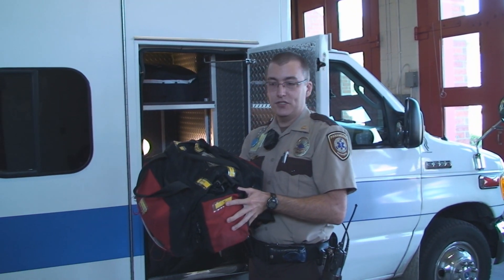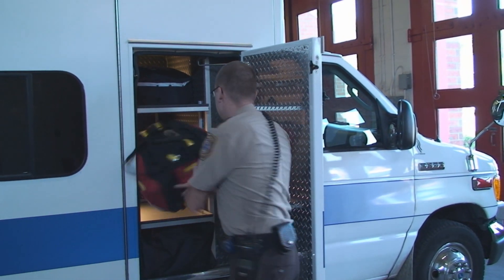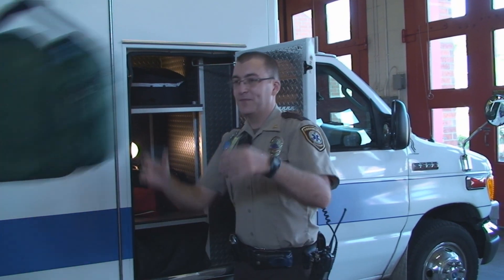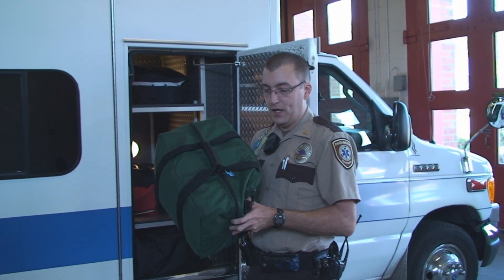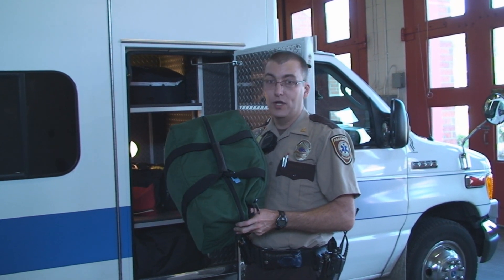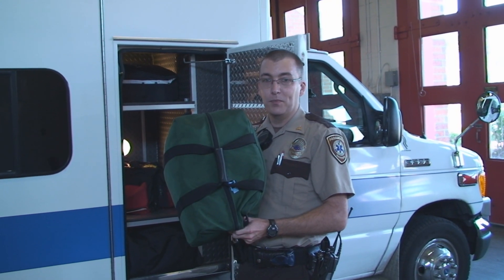This is a trauma bag — it carries accessories for helping people that are bleeding or traumatically injured. This is the advanced airway bag, for people that are in respiratory distress or not breathing, and it carries our advanced airways to help people breathe.